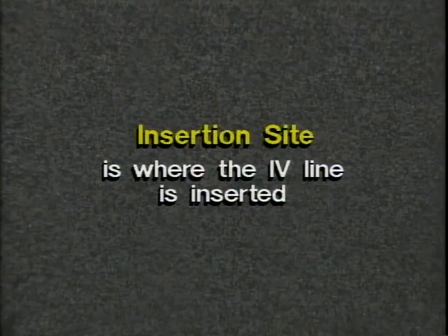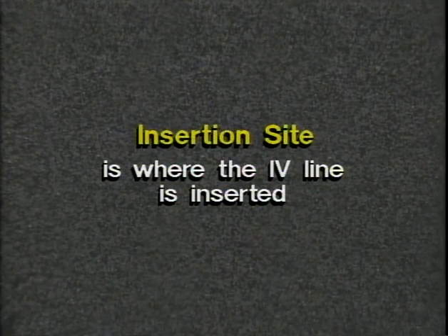To care for the patient receiving infusion therapy with a pump at home, you must have a basic knowledge of the system, specifically the insertion site, the rate of flow of the solution, and the pump. These factors influence the care you provide. The insertion site is the place where the intravenous line is inserted.